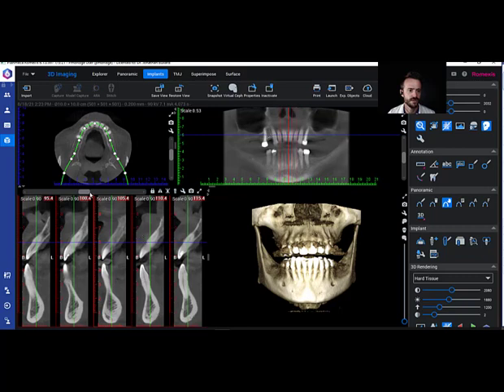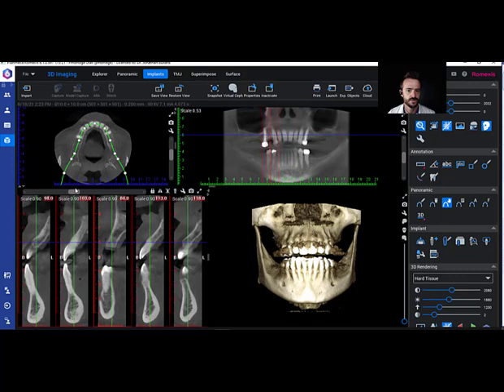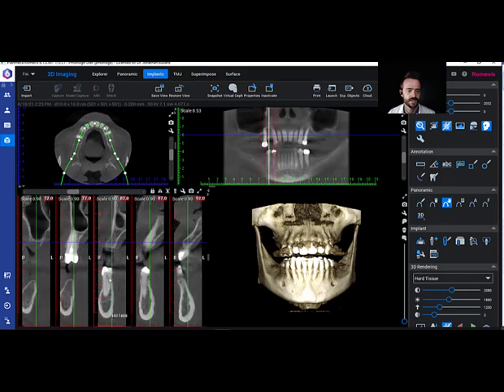Now we grab this bar and slide it back and forth. These five images represent the red lines on the upper right, so each one of those red lines is a slice. We're going to slide the middle line over to the number 5 site, and here we are — we can see the width of the ridge.